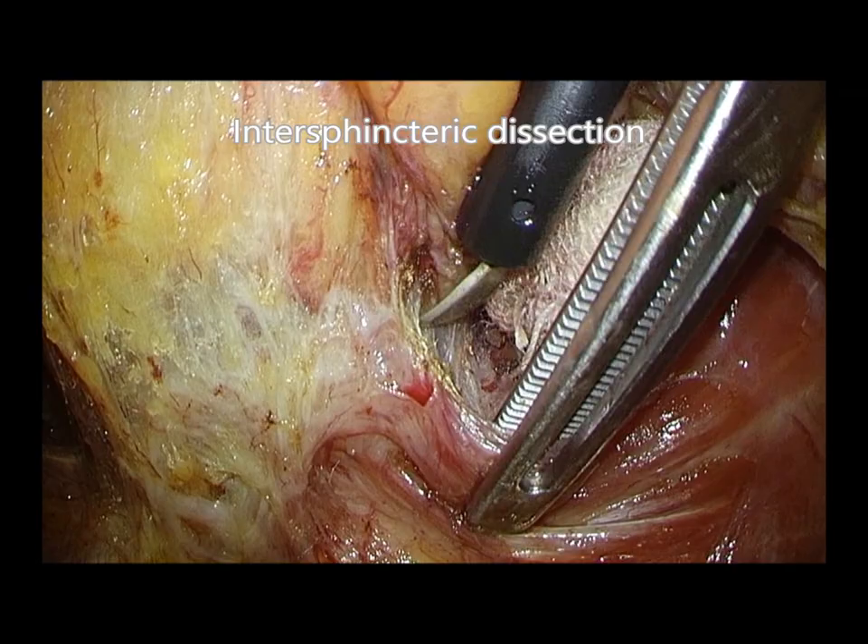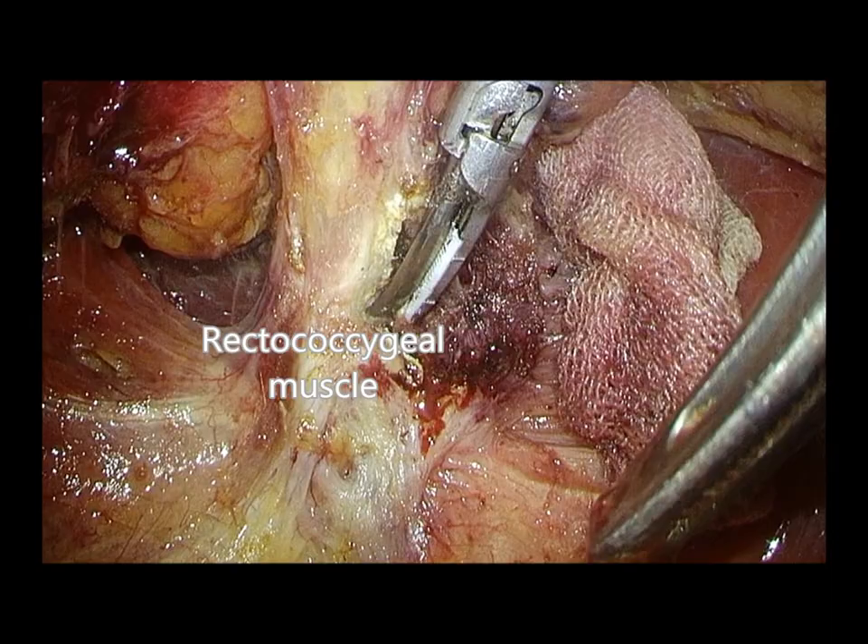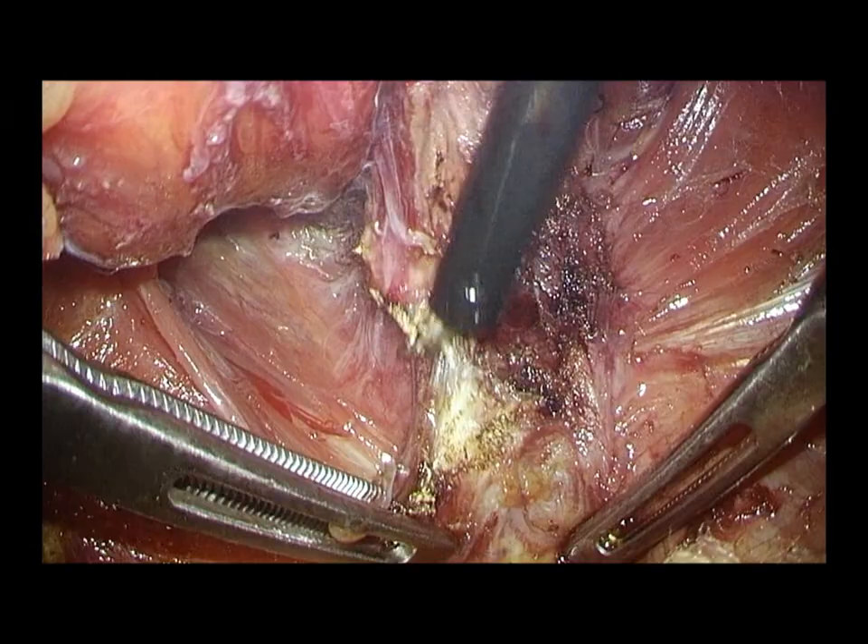Intersphincteric dissection starts from the dissection between the pubococcygeal muscle and rectal wall. Posterior to the rectal wall, the rectococcygeal muscle is divided. Careful attention is needed to avoid rectal wall injury.